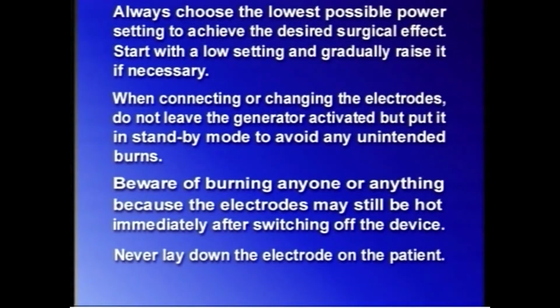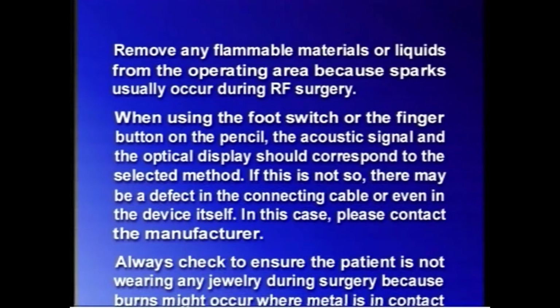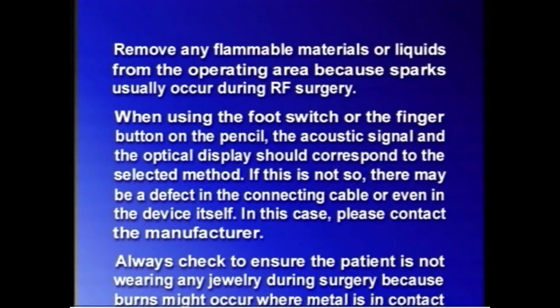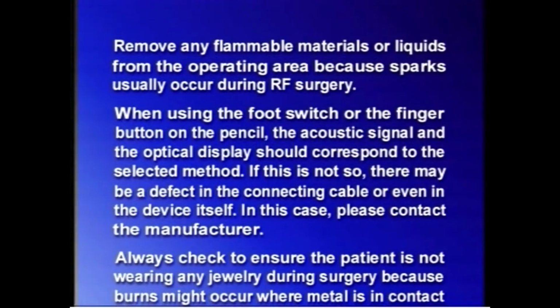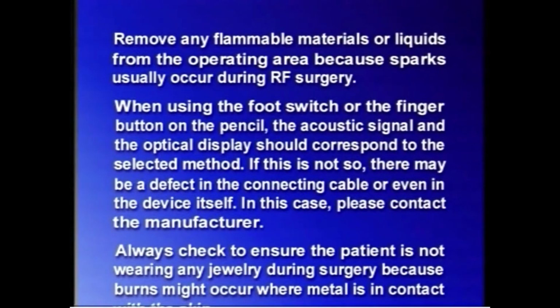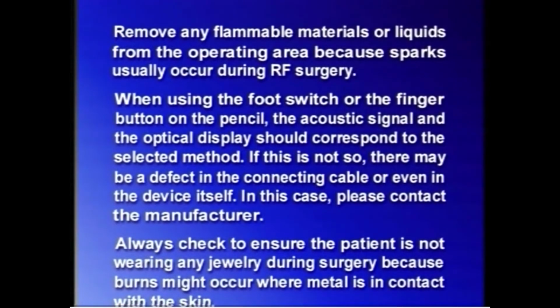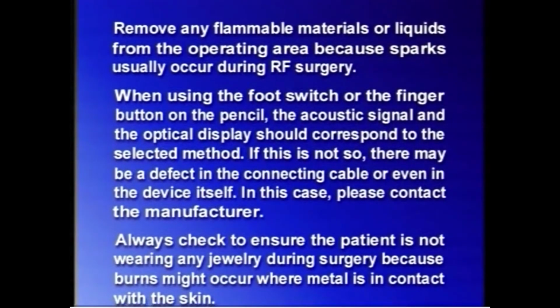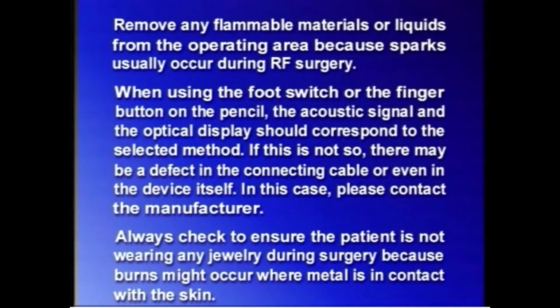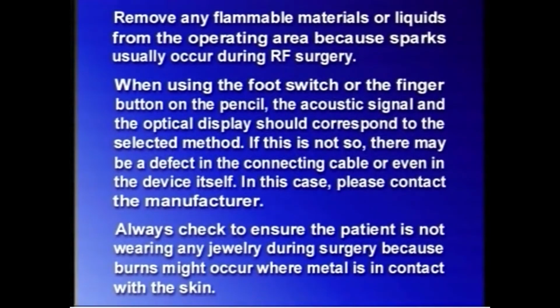Remove any flammable materials or liquids from the operating area because sparks usually occur during RF surgery. When using a foot switch or the finger button on the pencil, the acoustic signal and the optical display should correspond to the selected method. If this is not so, there may be a defect in the connecting cable or even in the device itself. In this case, please contact the manufacturer.